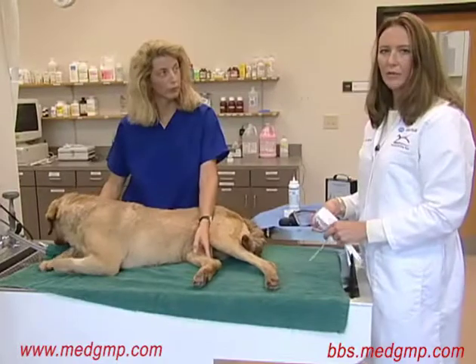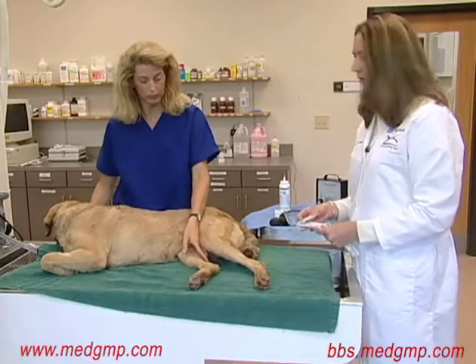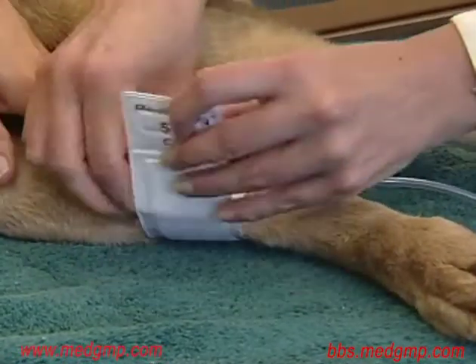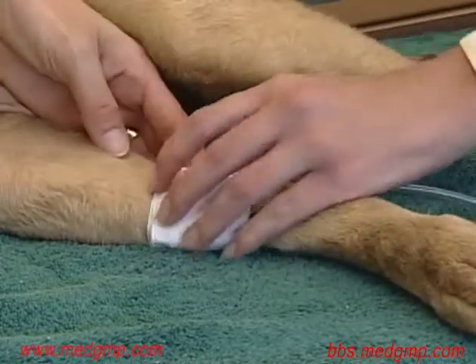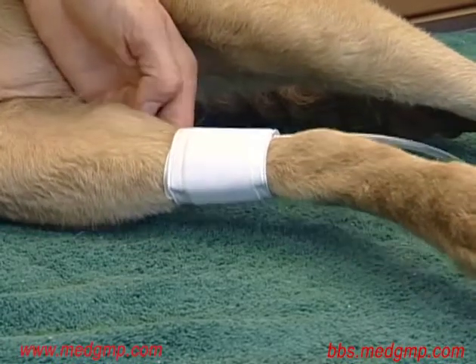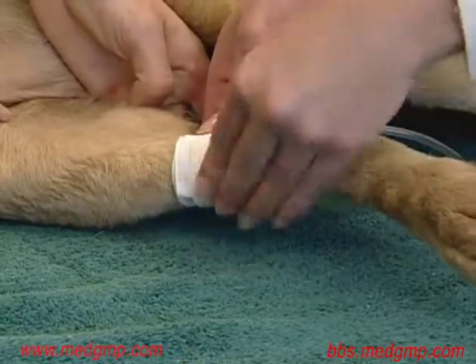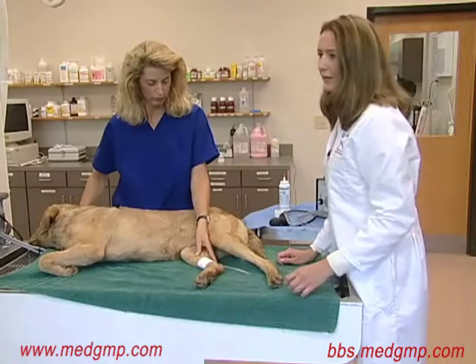If the measurement comes out in between, it's best to err on the side of the larger cuff to minimize error. Once we've selected our cuff, we're going to go ahead and place it in position. It's usually best to secure this with a piece of white tape to avoid the cuff from popping off. Once the cuff is securely in place, we're going to go ahead and locate the pulse.